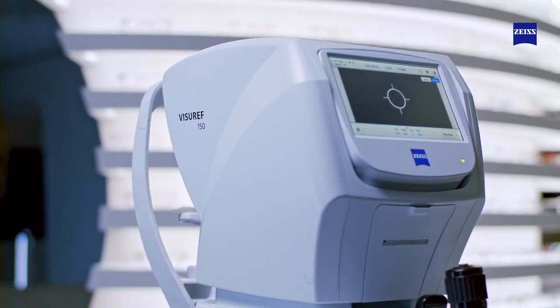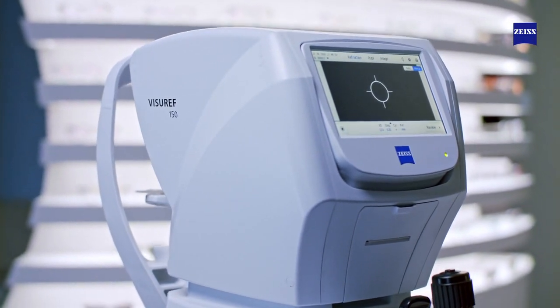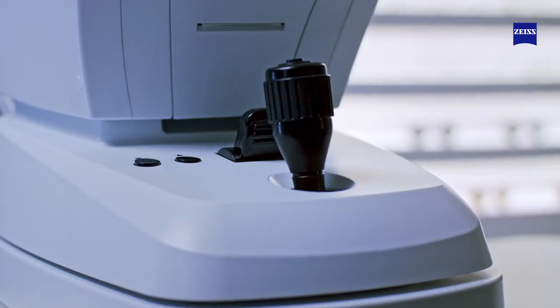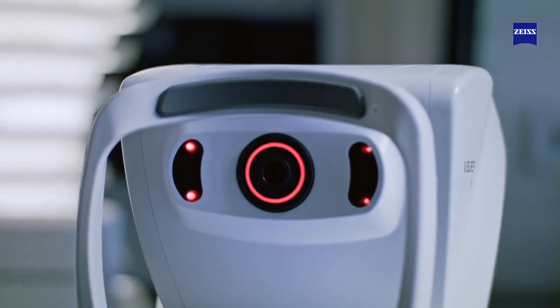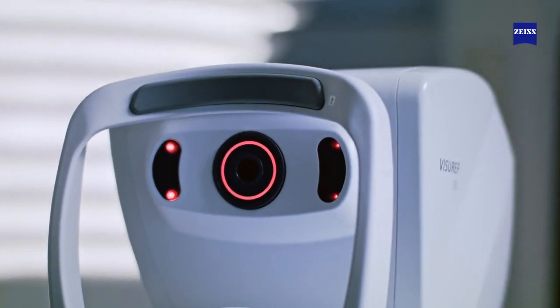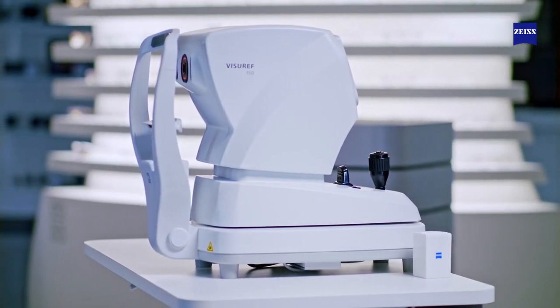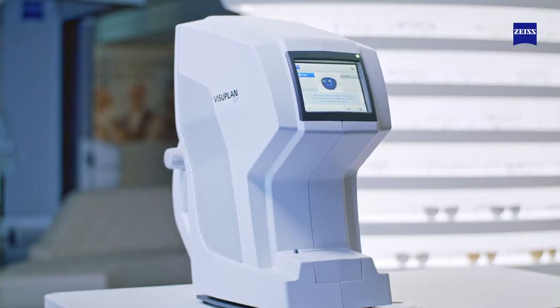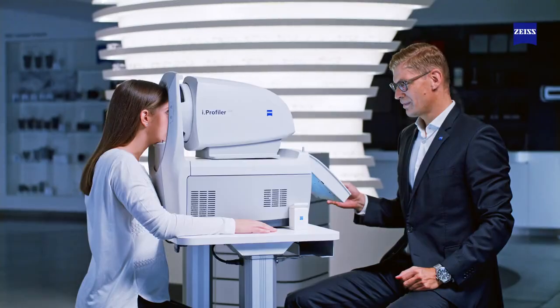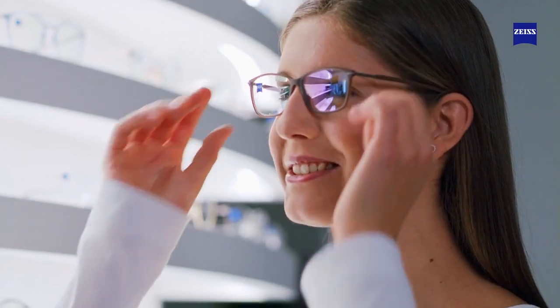The Zeiss Visu REF 150 has all the qualities needed to quickly become a valuable asset in your practice environment. Its modern communication technology allows the device to fit seamlessly into any practice by supporting efficient diagnostic workflows. Set your practice apart with more benefits for your patients — ask your account manager how to integrate the Visu REF 150 into your device ecosystem.